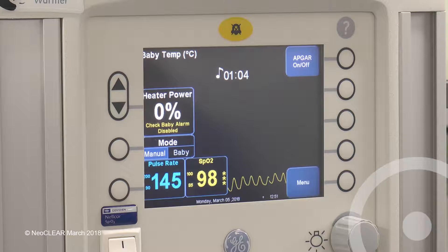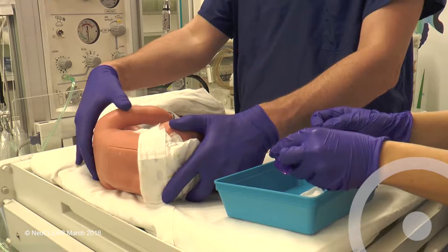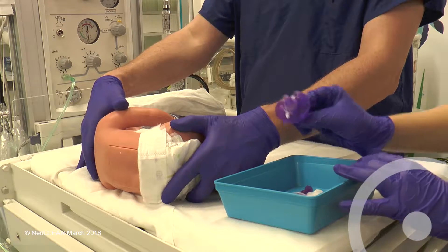The procedure can be stopped or paused if the baby is felt to be compromised. The first assistant can relax their hold while the operator rewashes their hands and puts on the gown and sterile gloves.